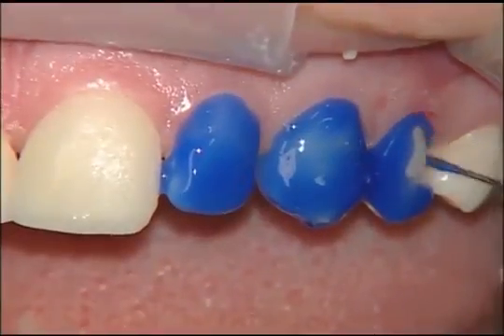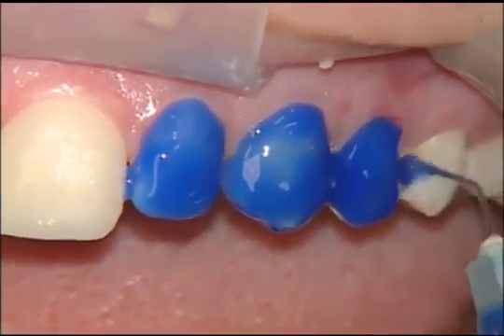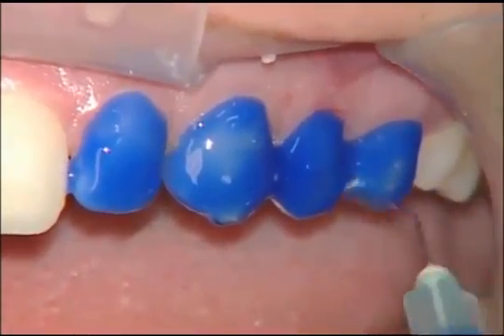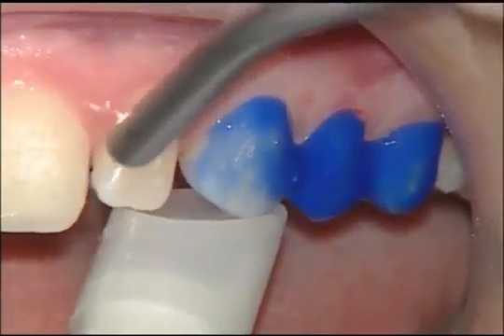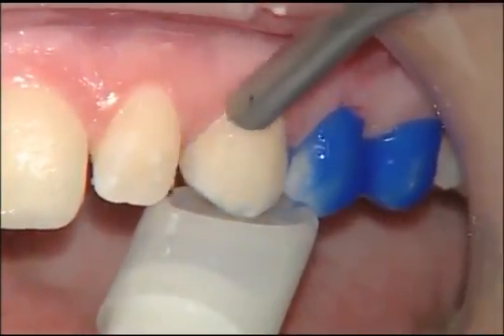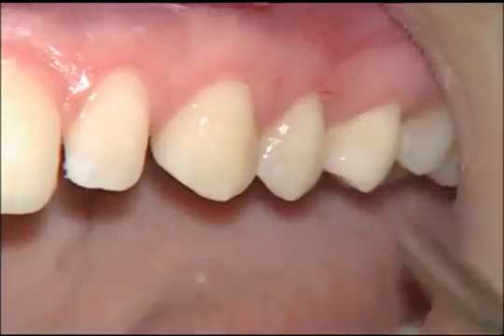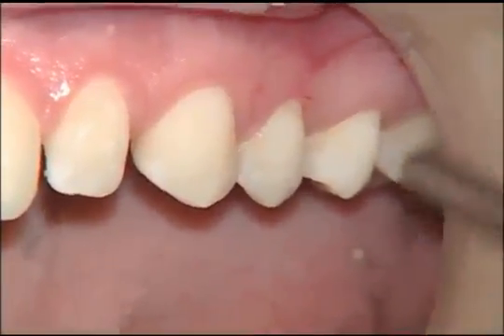So at this point, we're going to go ahead and etch the lateral incisor, the cuspid, and the first bicuspid. And we're just slowly moving our way posterior. We're going to get the second bicuspid here, and then because these veneers do wrap onto the occlusal, we will get some etch on the occlusal surfaces as well. Then after waiting 15 seconds for the etch to take place, we will rinse off all the acid etch from these teeth and dry them, and then follow the same bonding steps that we proceeded with before on the central incisors.